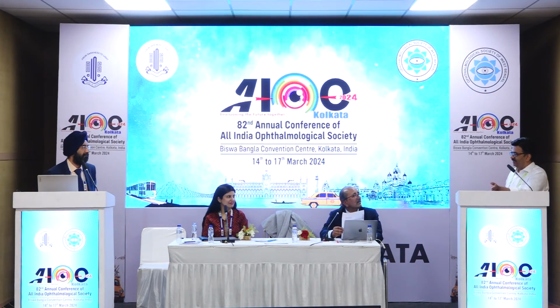Suppose the other eye is slightly more myopic, then what is the choice? Suppose the better eye, which doesn't have cataract, has myopia of 4-5 diopters. Then what is the choice? I think there are certain situations where the other eye is myopic and the cataract is in one eye.